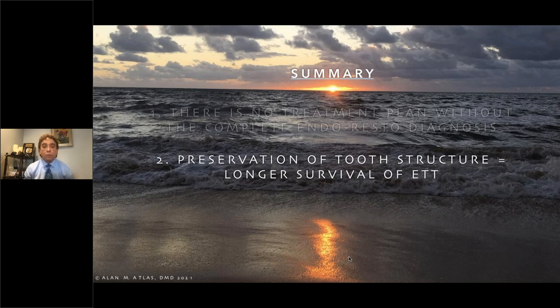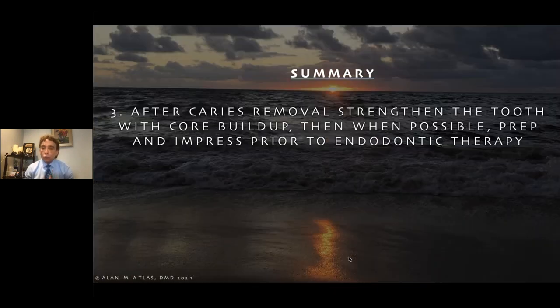It is not because of embrittlement, it's because of excavation of too much tooth structure that causes the failure of these teeth. And poor crown, of course. After caries removal, remember this rule, strengthen the tooth with the core buildup. Then when possible, if you have time, impress it, whether it's scanning or milling, scanning or conventional impression.